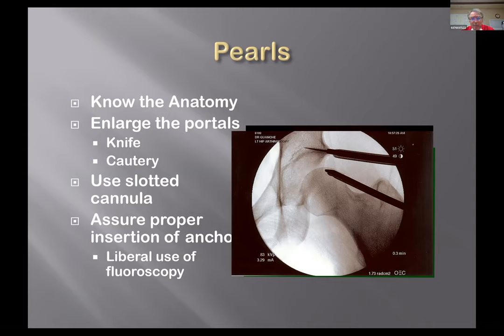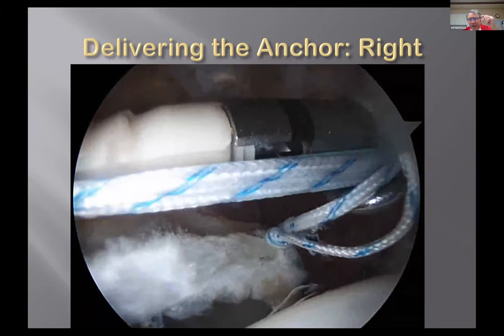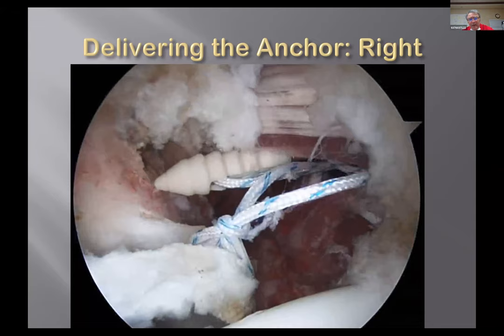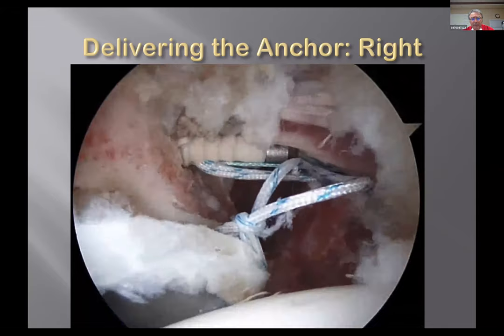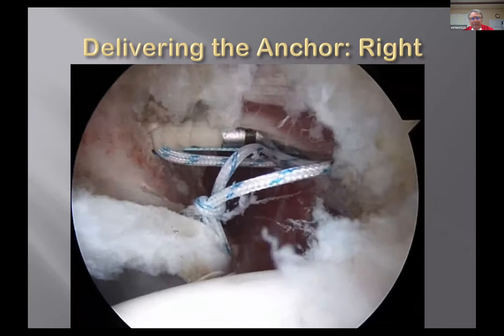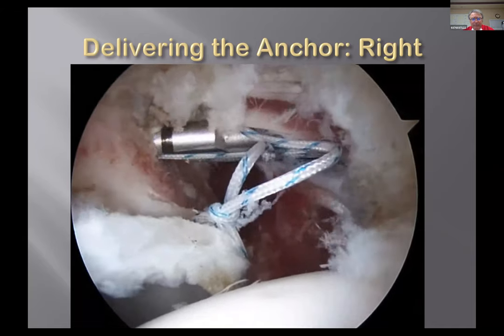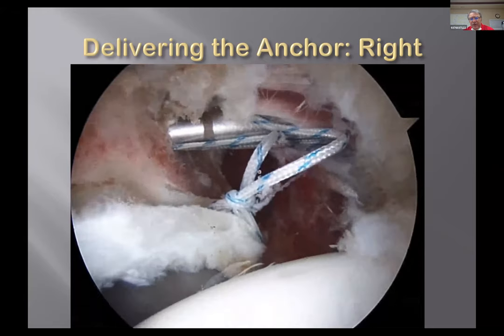I mean, you got a great view. You can put your anchors in at the proper angle. And then once you do that, you can either use this, a knotless anchor. He's already got the suture in the labrum, listening to some music. There's your hole for that. So, just tap it to the tap line. And then this has a little twist. And as you twist it, you can tension your labral repair, not over tighten it or under tighten it.